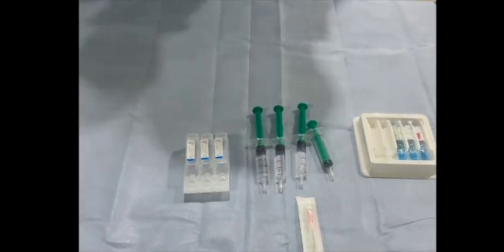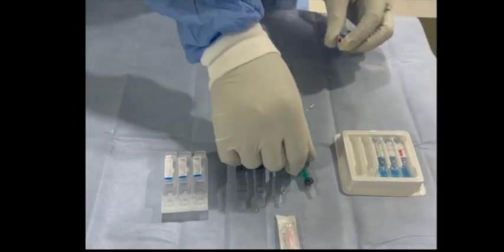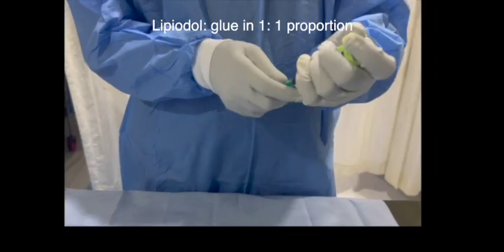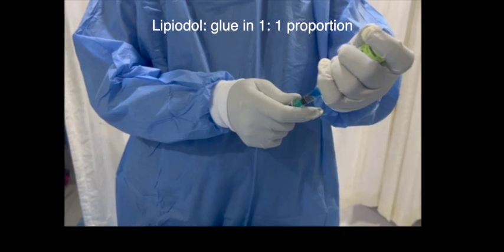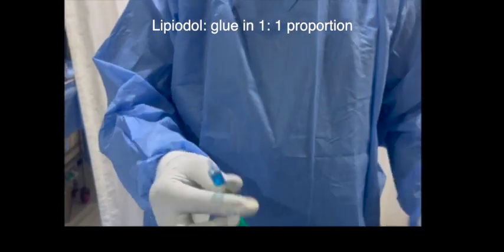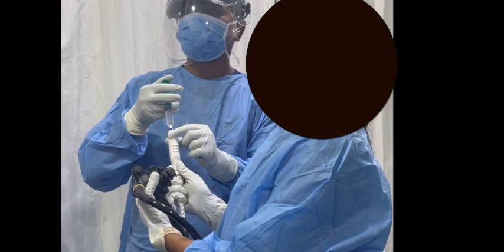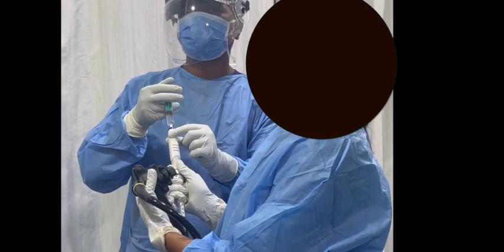An ex vivo clip is showing glue preparation. Take an empty sterile 2 ml syringe, fill it with 1 ml glue and remove the air. If lipiodol is being used, take 1 ml of lipiodol in the glue syringe and mix it well for uniform distribution. After each coil deployment, flush the needle with 1 to 2 ml of distilled water.